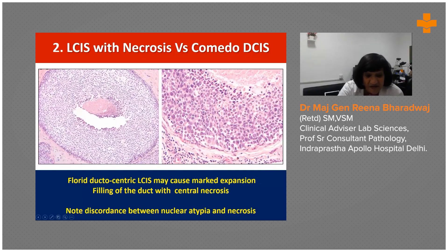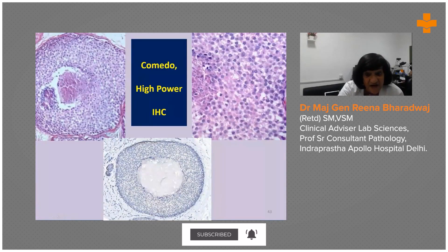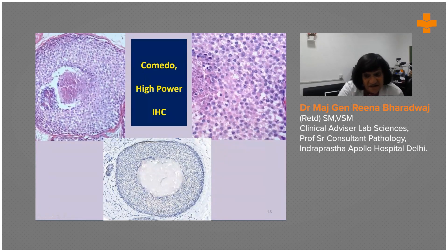There is a florid ductocentric LCIS with marked expansion filling the duct, and here we call it central necrosis — we don't use the word comedo. There is a complete discordance between the amount of necrosis and the nuclear grade. This is very monomorphic. In comedo DCIS there is comedonecrosis with nuclear pleomorphism. High-power views confirmed on e-cadherin show monomorphic cell types with necrosis but with intracytoplasmic vacuoles, and the cells are nicely separated from each other.